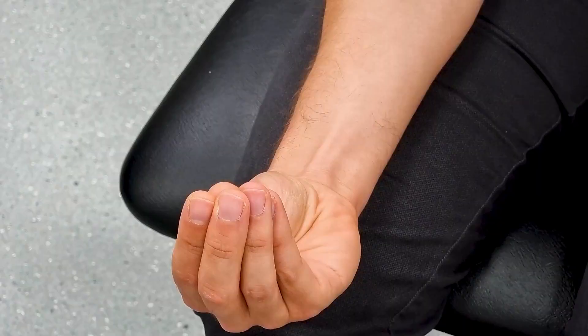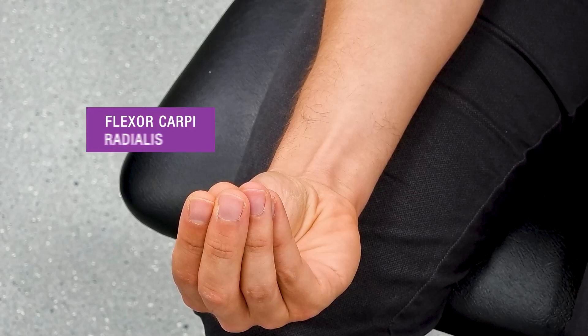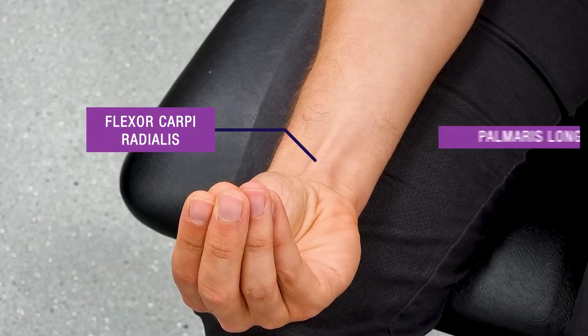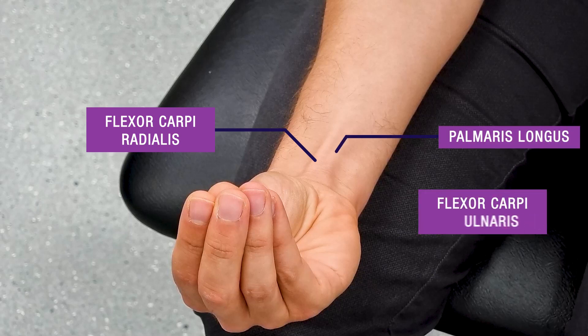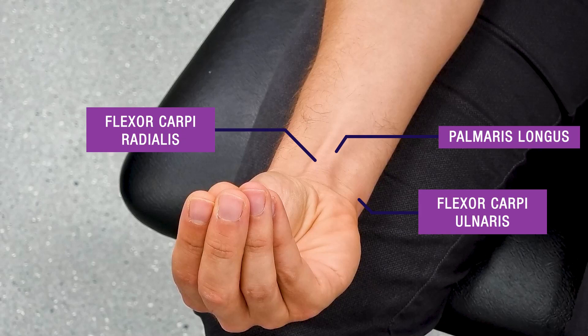Finally, as we move down to the wrist, we can see the tendons of the muscles of the anterior forearm. We can see the tendon of flexor carpi radialis, palmaris longus, and flexor carpi ulnaris.